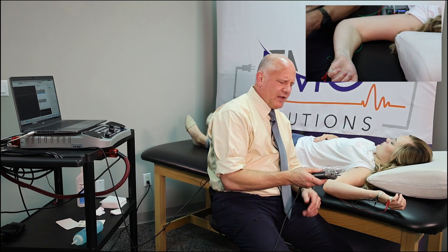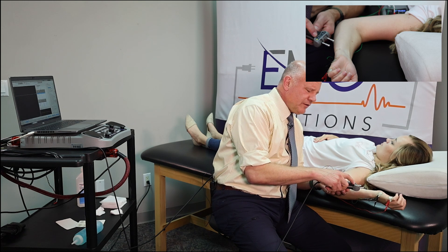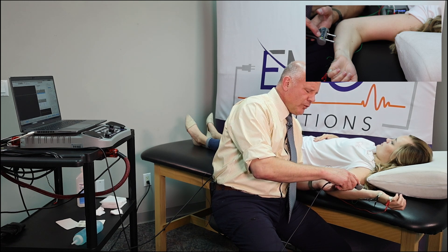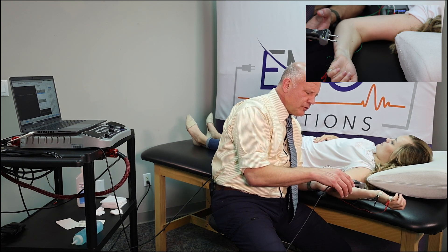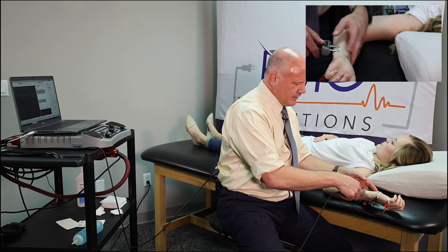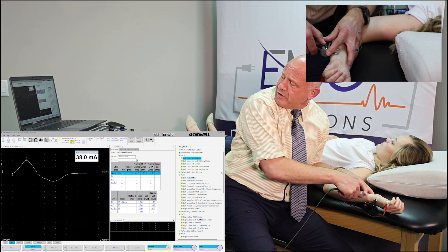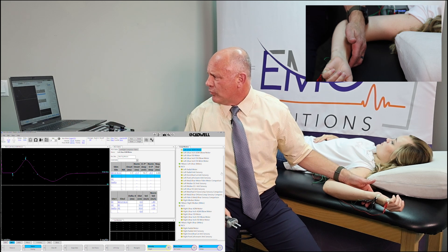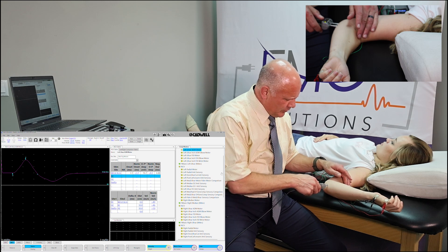I'm going to put just a dab of gel on our stimulating probe. I like to point this out on every case: you'll see that we've got the cathode highlighted with the negative pole — we want that negative pole, that cathode, close to our active electrode. Let's go ahead and stimulate right here at the wrist. We got a nice response from the ADM. We took the stimulus up a little bit more and got a tiny bit of increase in the response.